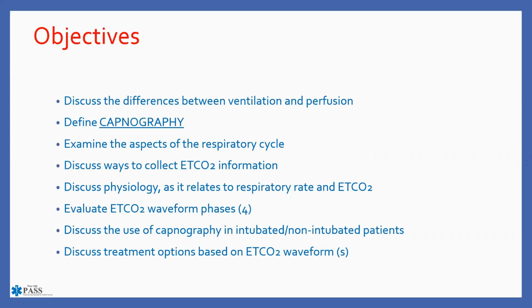We'll also examine the aspects of the respiratory cycle, talk about different ways to collect the end-tidal CO2 information. And that's what I was just referencing with looking at some of the historical approaches and how we can best obtain information if we do in fact have a patient that has an endotracheal tube through their glottic opening, because that really does become a medical legal thing. If we have a patient in that situation where we have taken their airway or intubated them, we need to make sure that we have good objective feedback to ensure that the tube is still through the glottis and we can ensure that the patient is being oxygenated and ventilated appropriately.